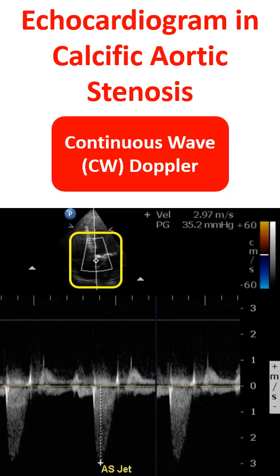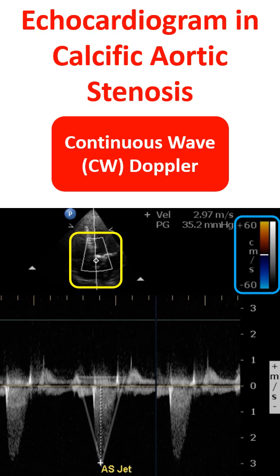The upper panel shows the color Doppler image and the Doppler line. The color bar at the top right shows the Nyquist limit of the color flow mapping system, 60 cm per second in this case. The lower panel shows the tongue-shaped envelope of valvar aortic stenosis. The peak velocity in this case is 2.97 m per second, which corresponds to a gradient of 35.2 mmHg.